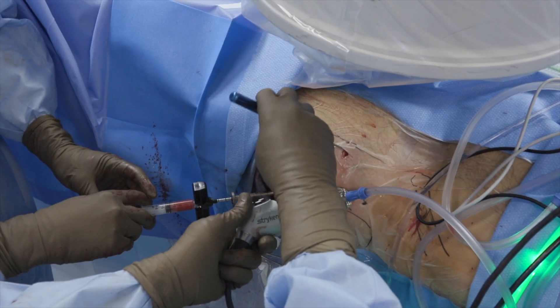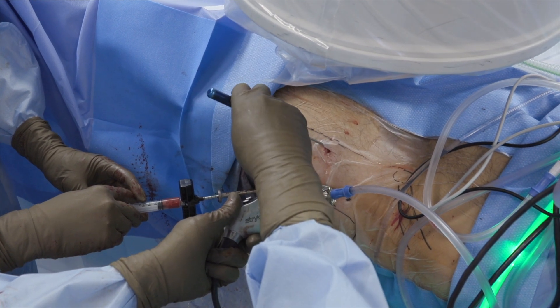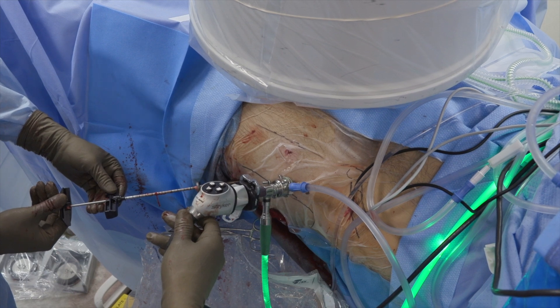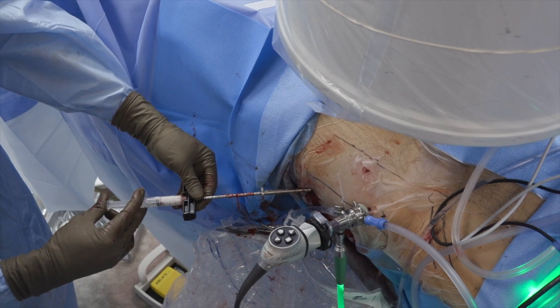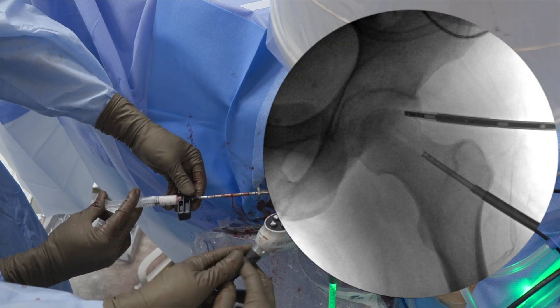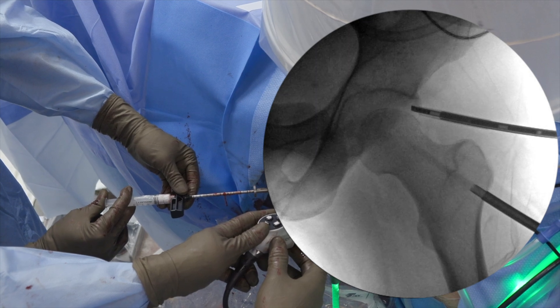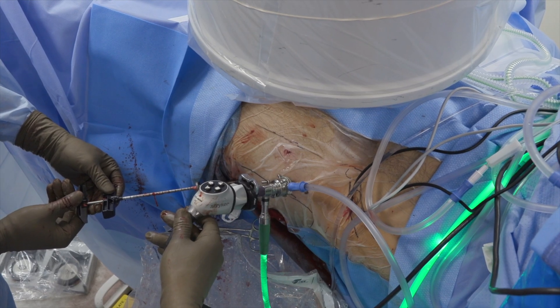Once this was complete, the track was irrigated and the mix of BMAC and demineralized bone matrix was injected. The stylet of the needle can be used to ensure that all of the BMAC is delivered. Calcium phosphate graft was then used to backfill the decompression more distally. The guide can be slowly withdrawn as the calcium phosphate is delivered. The stylet can be used to clear the needle.